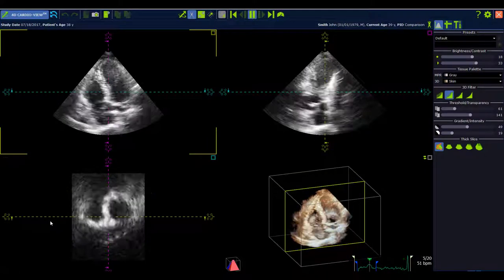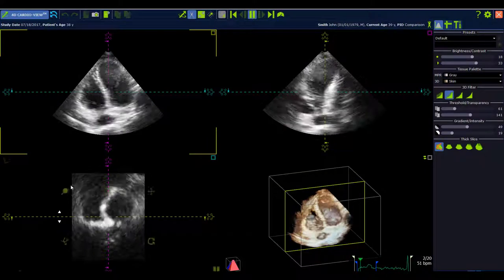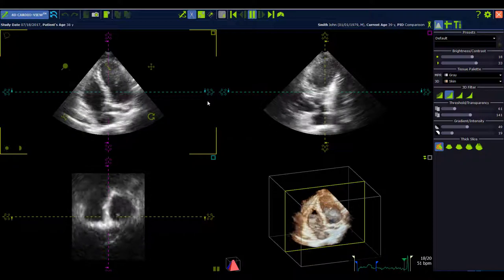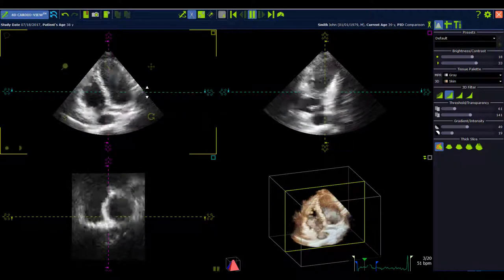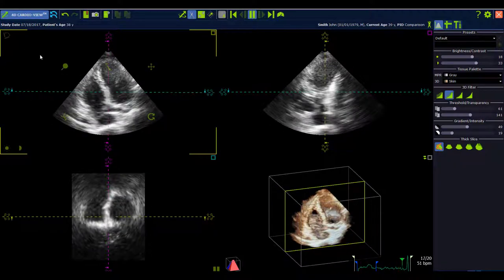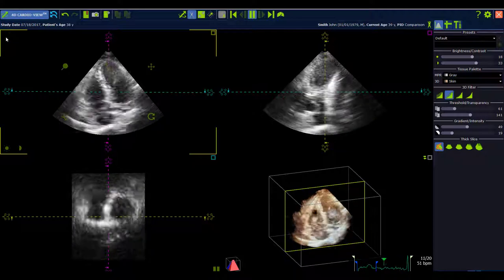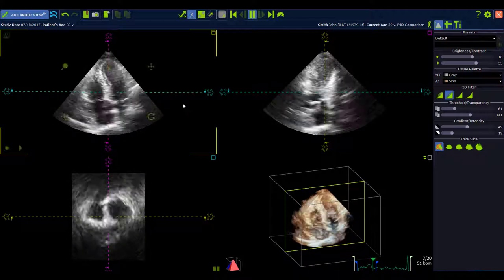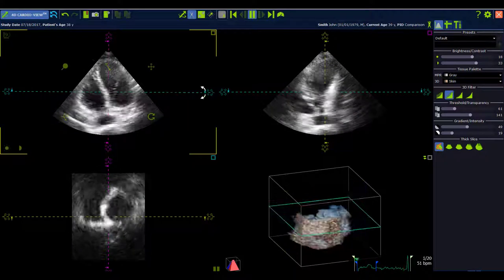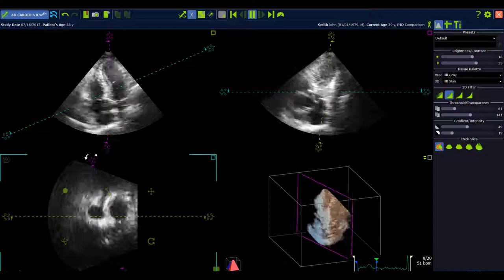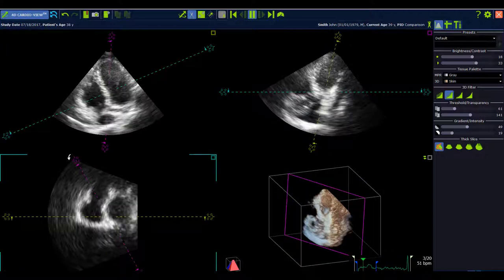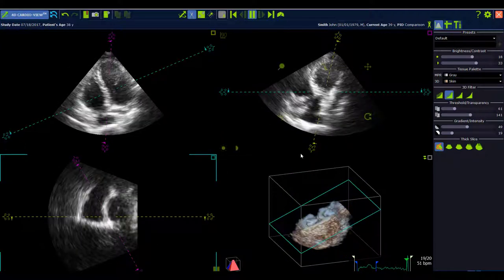For the cardio view, we also added the free mode for the lines of intersection. The lines of intersection are connected so you can move them in 90 degrees to each other. There is a button in the left corner for the free mode, and after pressing it you can freely move all the lines of intersection and create your own views.